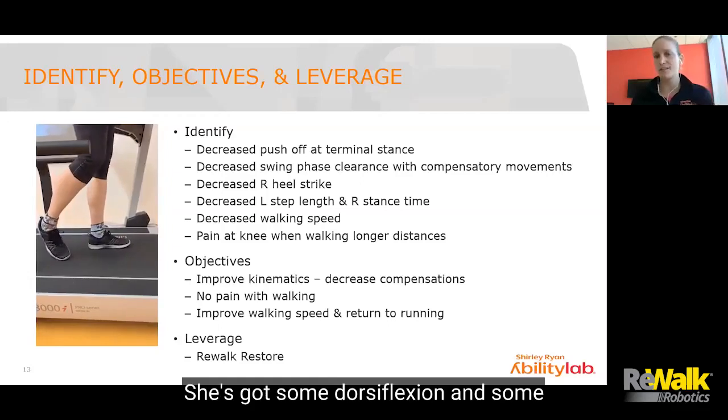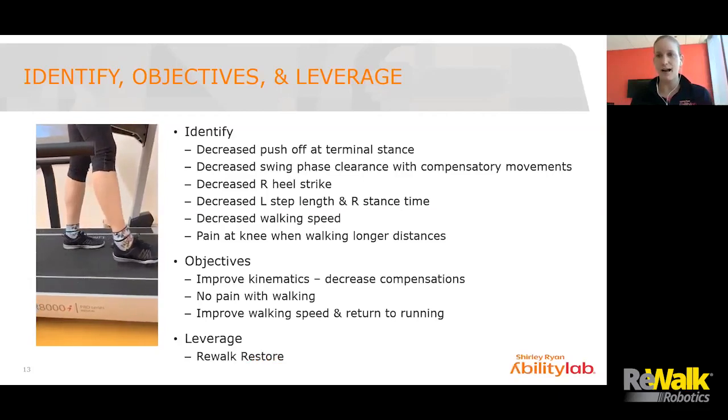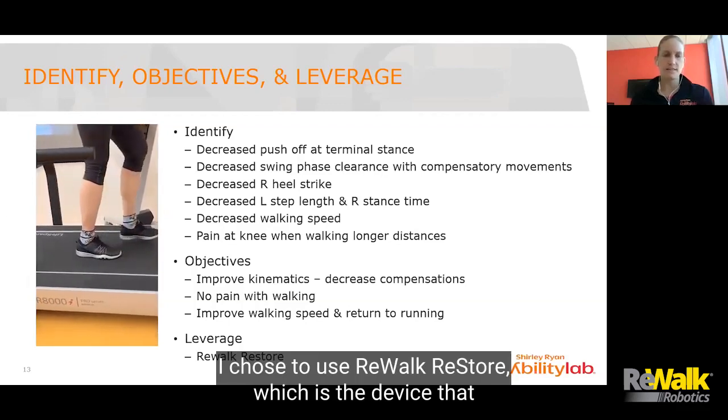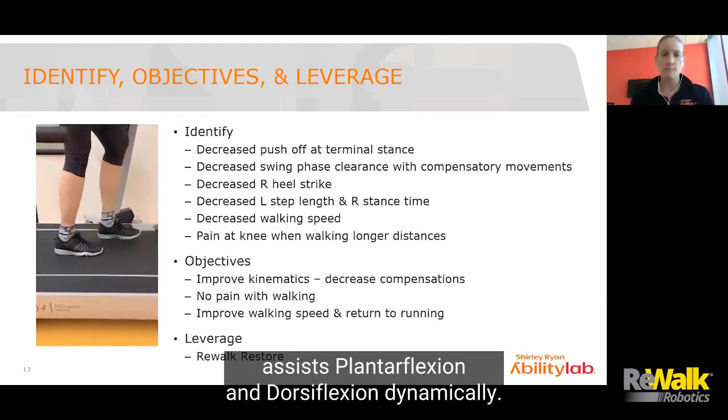She's got some dorsiflexion and some plantar flexion ability, and we just got to enhance it for her. So I chose to use Rewalk Restore, which is the device that assists plantar flexion and dorsiflexion dynamically.